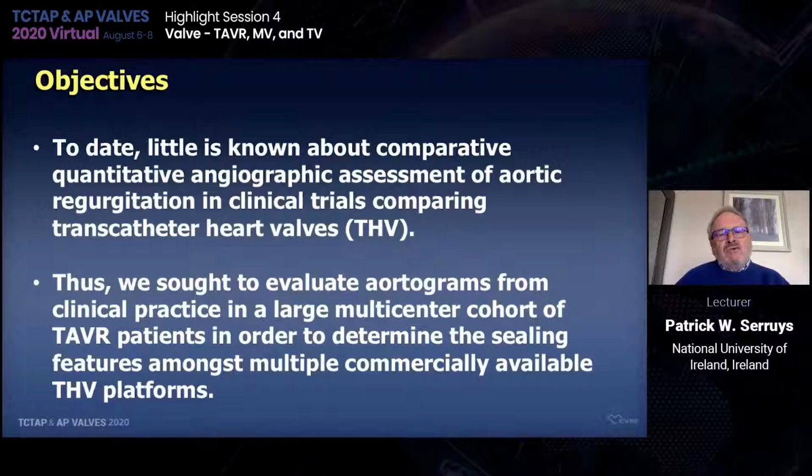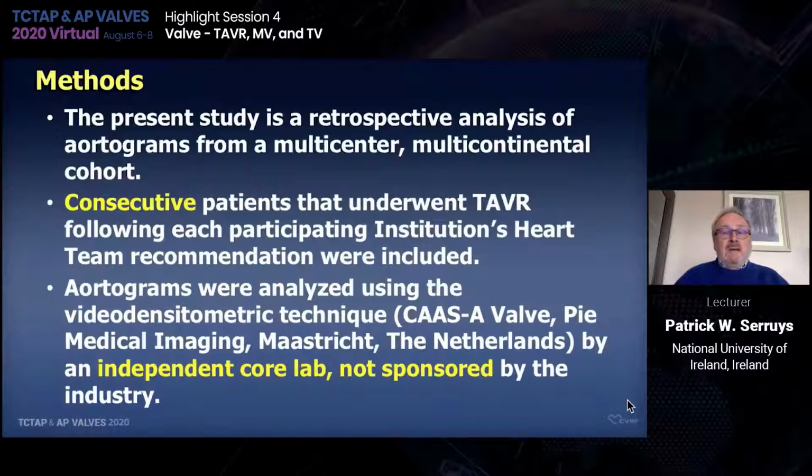So we thought to evaluate aortograms from clinical practice in a large multi-center cohort of TAVI patients in order to determine the features among multiple commercially available platforms. It is a retrospective analysis, we have to say, but from a multi-center and multi-continental cohort.